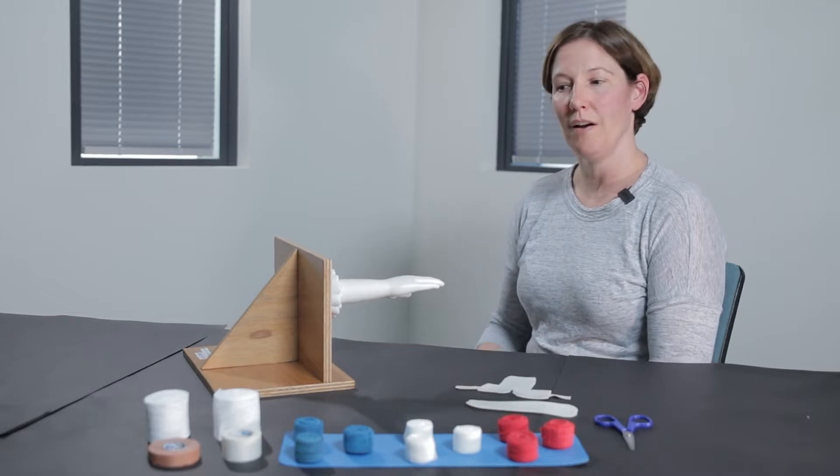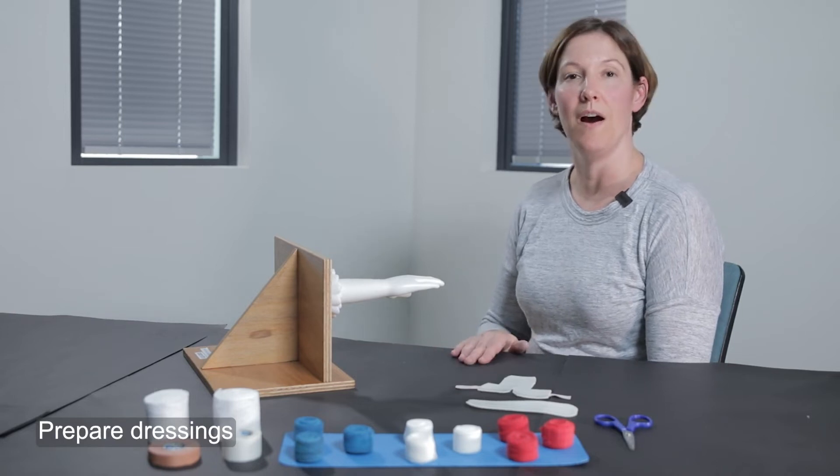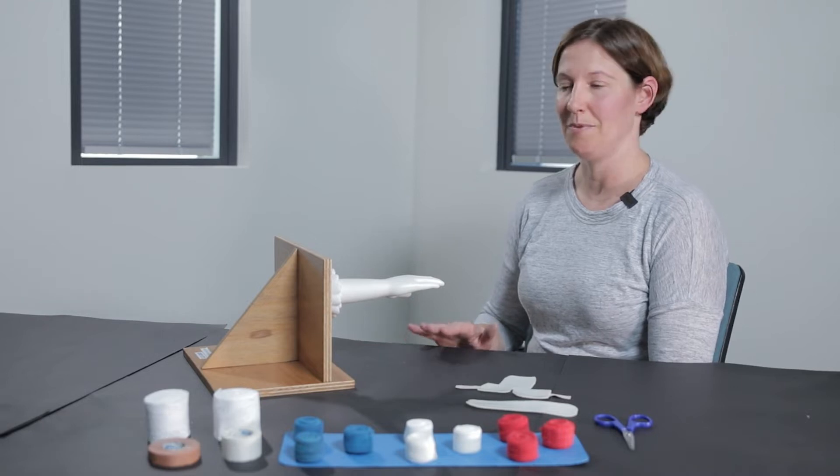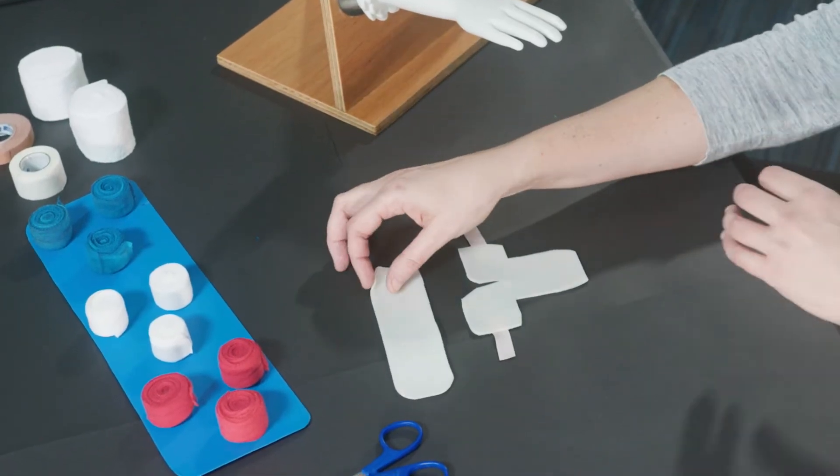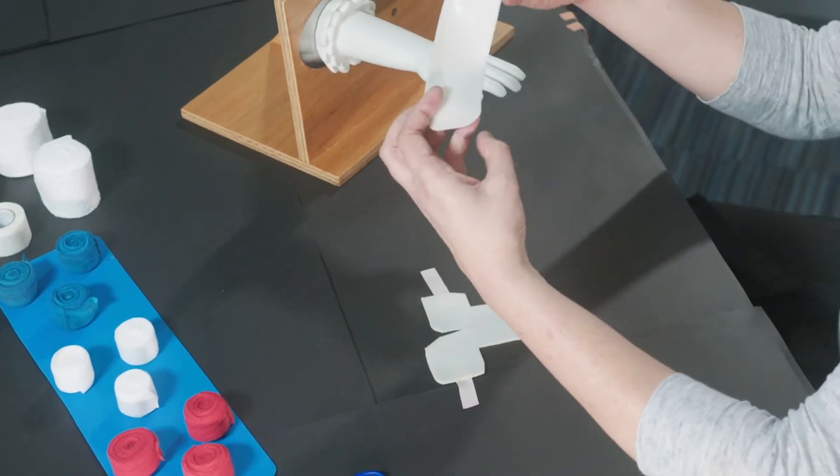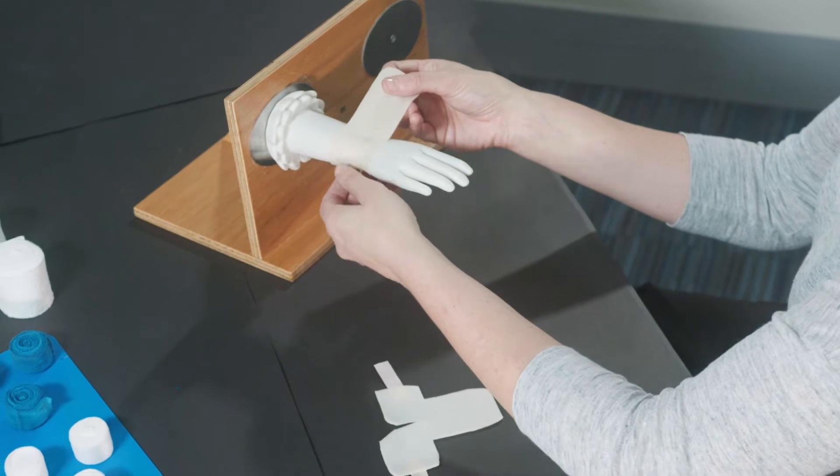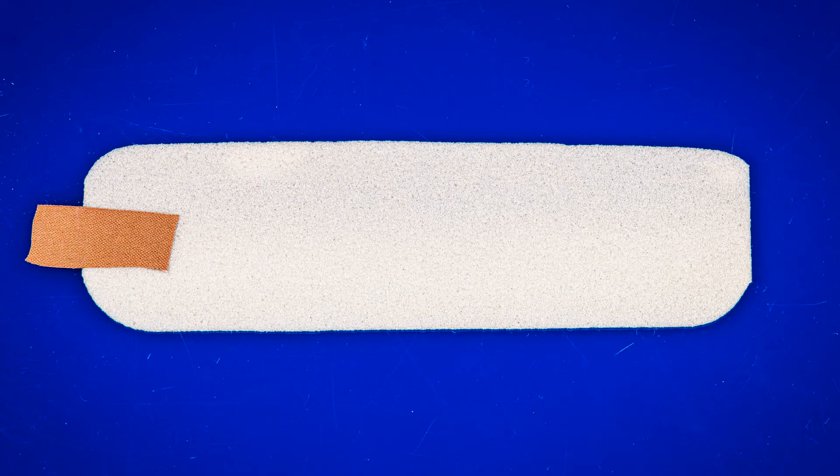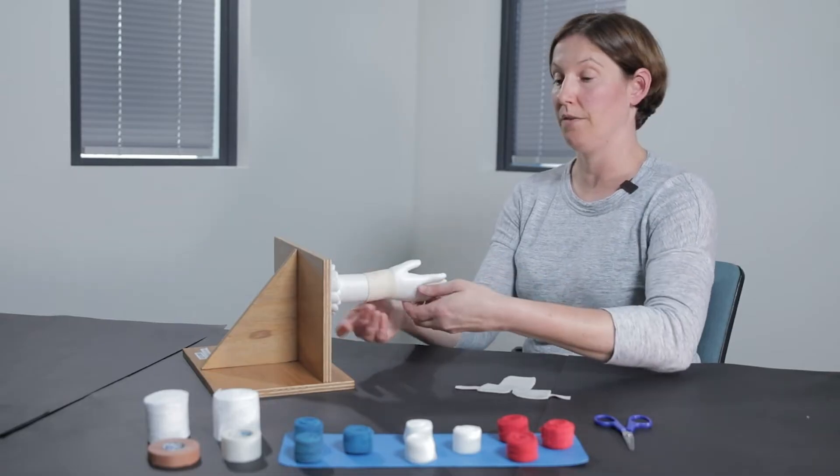It's really important before you begin to prepare all the dressings and products that you require prior to bringing your child over to get started. I'd like to show you first the way of preparing the hand, particularly for children with EB. We're going to secure a layer just around the wrist to provide a layer of protection prior to using the soft bandages we have in front of us today.